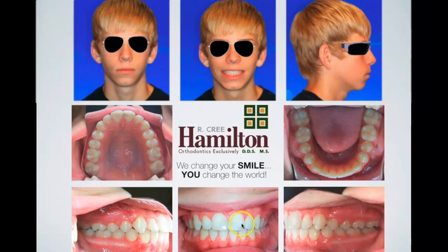Basically, you have a T slot here. One T goes on the wire this way, and the other T goes this way. Then you place a wire that you bond with composite onto the TAD, and then you place an open coil spring here, and it extrudes, and you move those teeth down as a unit. You hold them there for a few months, and then you take it off. One of the things you'll also want to do mechanically is put some curve of Spee into the upper wire.